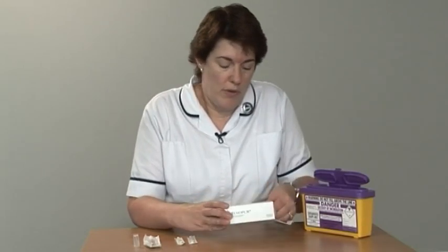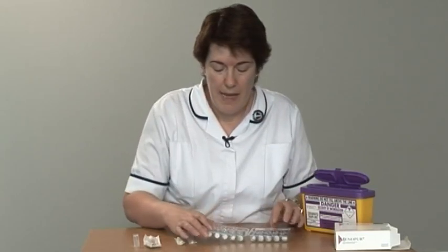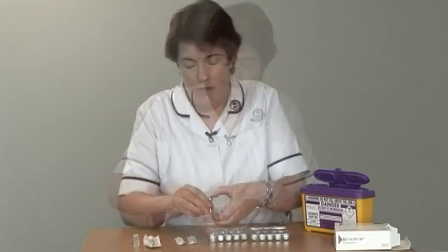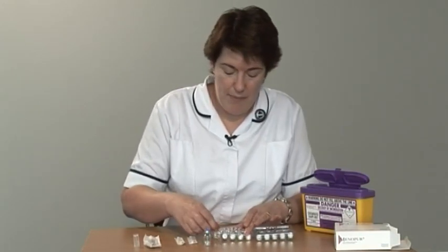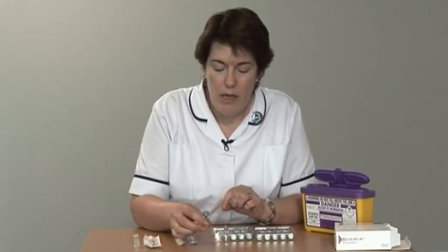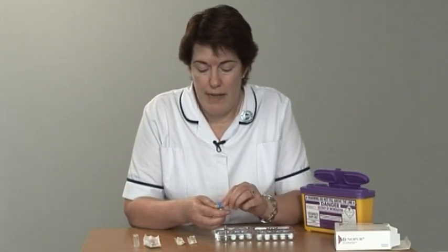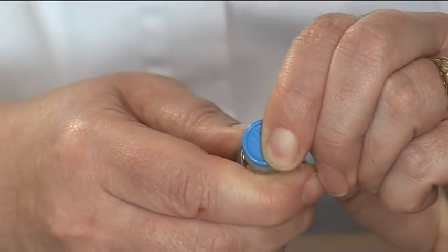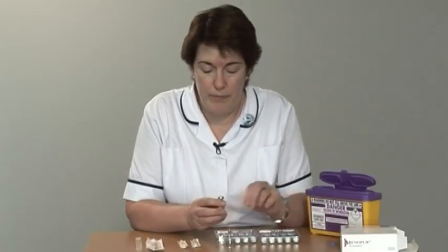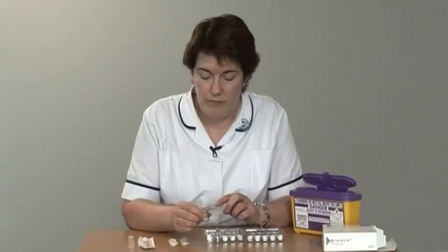When you open the box, what you will see inside is 10 vials with a blue top of powder and 10 ampules of diluent. The blue top flips off, so just put your thumbnail underneath it and snap it off, and it should come off quite easily. You can now dispose of the blue top. What you will see is a rubber bung in the centre of the top of the vial.